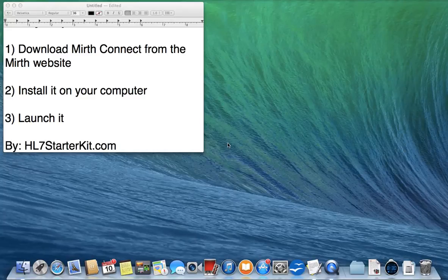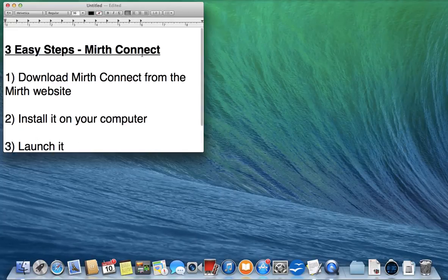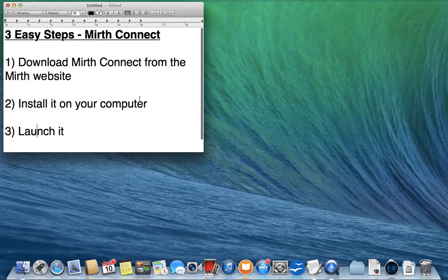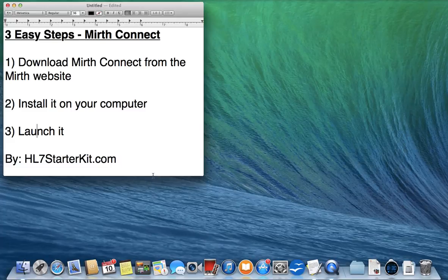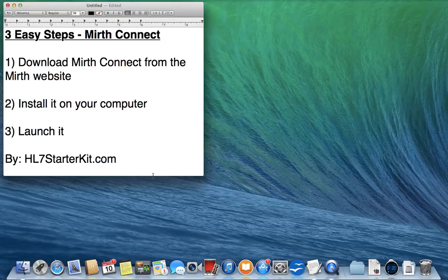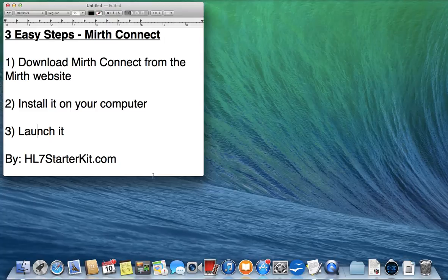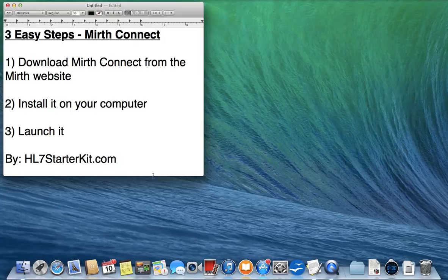Hello, this is HL7starterkit.com. I wanted to shoot a video to help those who have never installed Mirth Connect. We're going to install Mirth Connect right here, quick and easy. We're doing three easy steps: download Mirth Connect from their website, install it on our computer, and launch it.